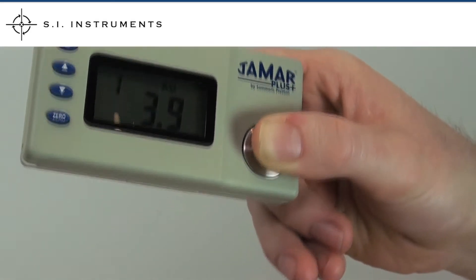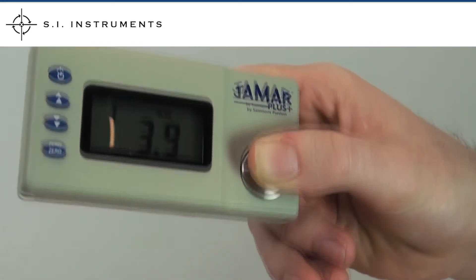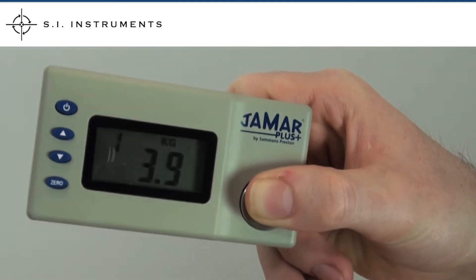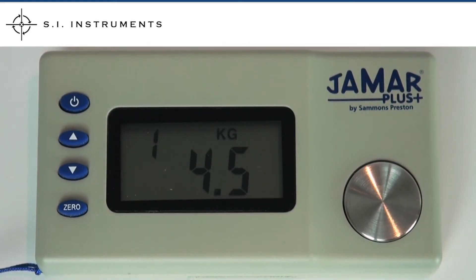To take a measurement, locate your thumb and finger on the dedicated pads and squeeze. The force is immediately displayed on the crisp LCD display. In this example, the value is displayed in kilograms.